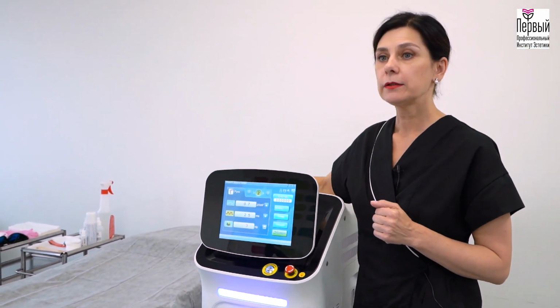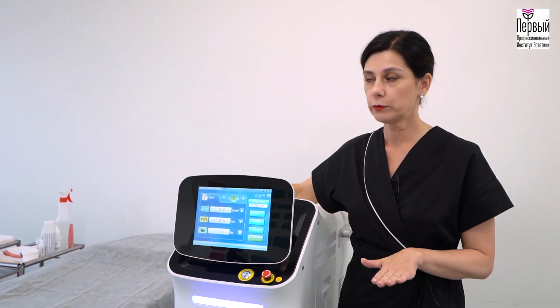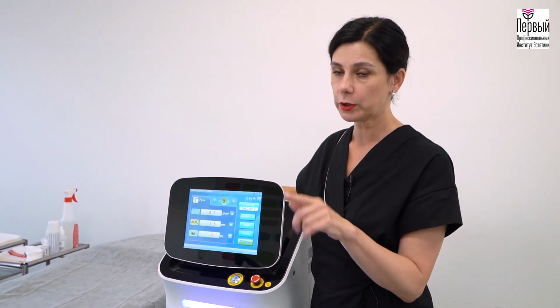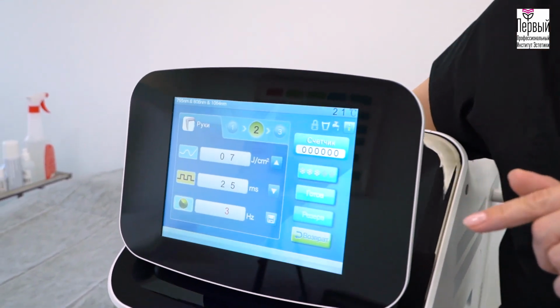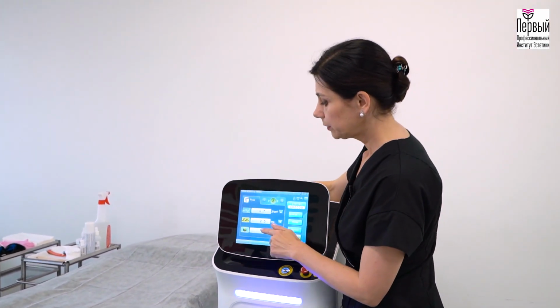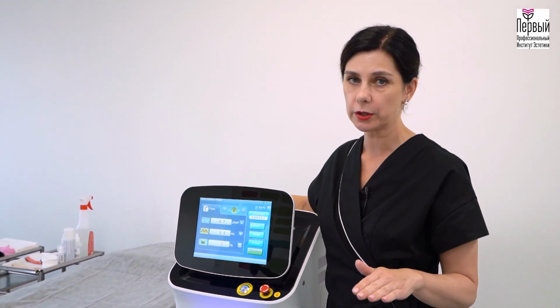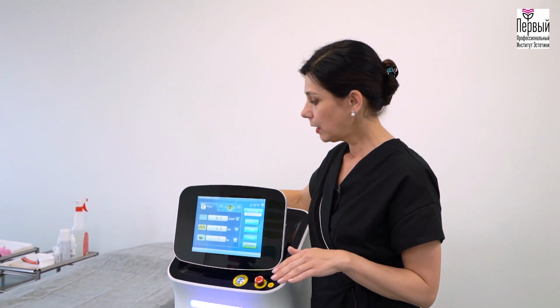The frequency and the operating speed determine the depth of pulse penetration into the skin. The higher the frequency, the less depth the flash exposure. The lower the frequency, the deeper the flash exposure. For large areas that are known as cold areas, the frequency must be 4 or 5. Those areas are large and the hair is not so deep there. Therefore, their epilation should not take much time and the duration of the entire procedure will not be affected.